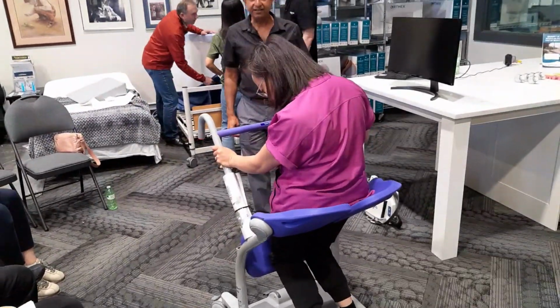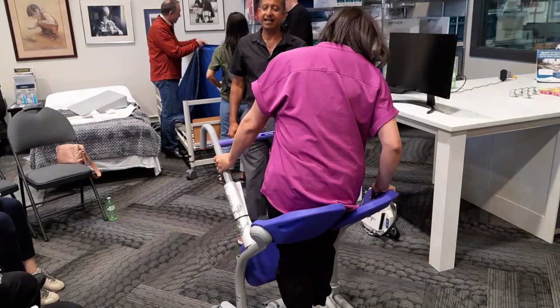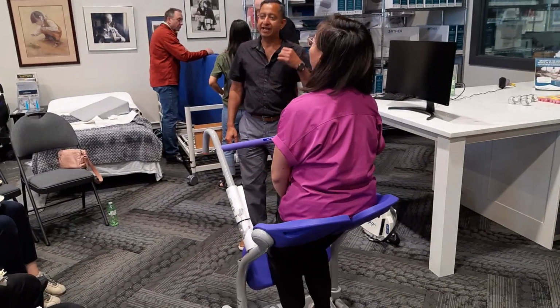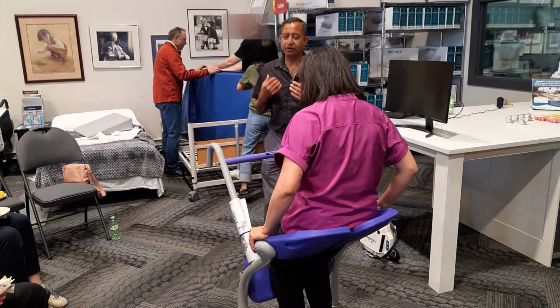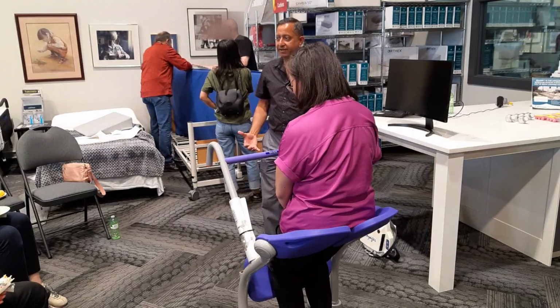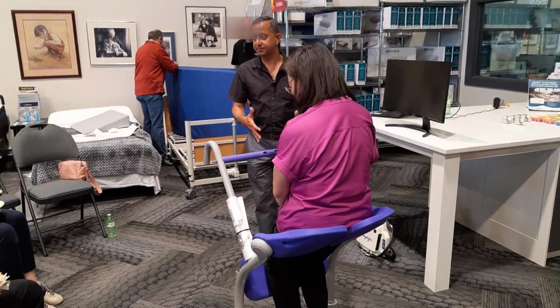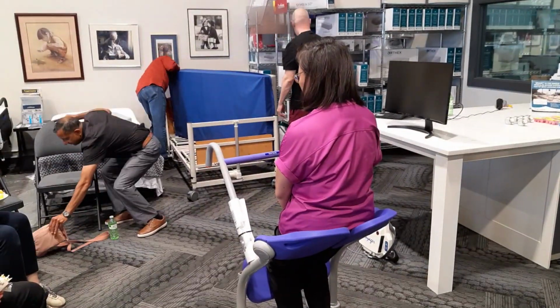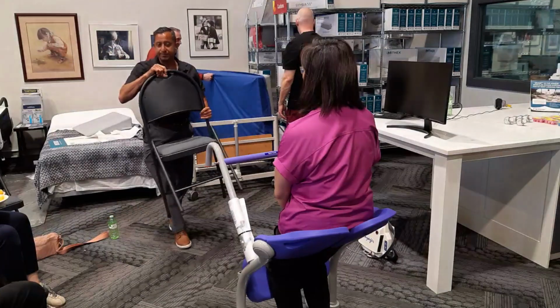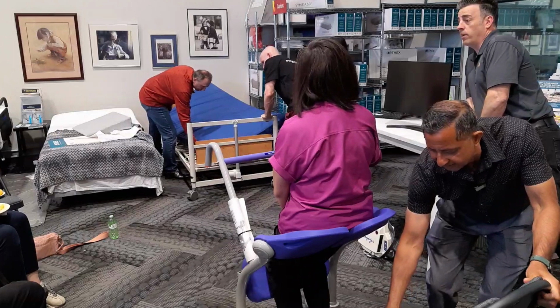Generally, again, you have to use it on residents who still have weight-bearing capability and who can still understand the instructions. If they can't understand instructions and do not have enough load-bearing capability, then you have to go to the next lift. You cannot use this particular device. So here, I'll just move this chair for a second. 400 pounds.